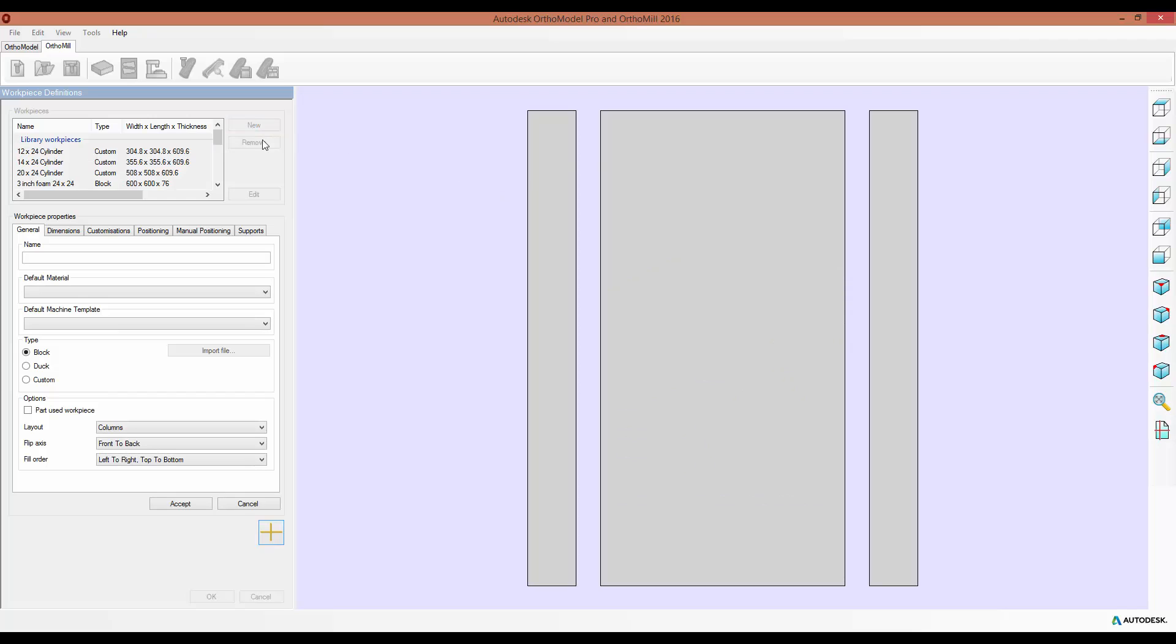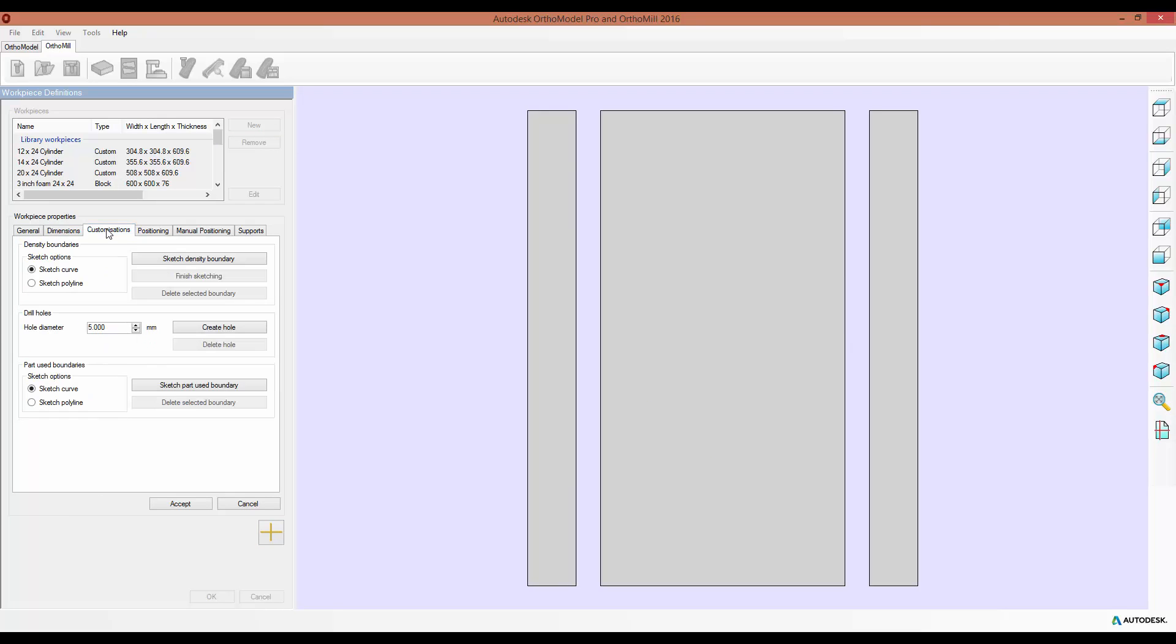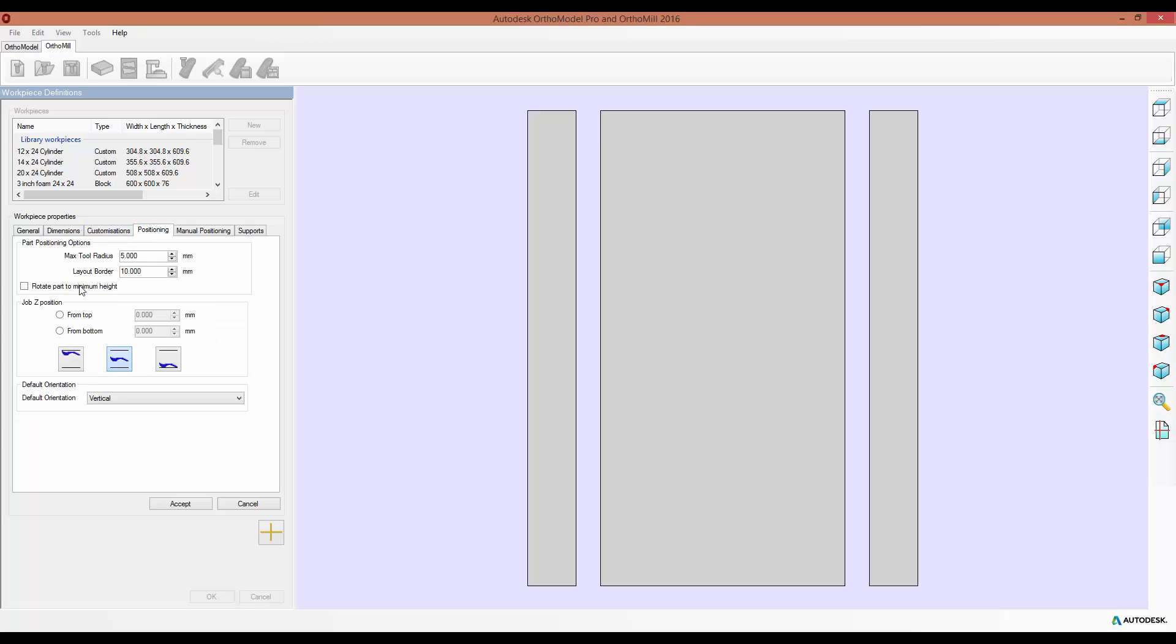So you can fill in all the information in the tabs which you already know. And then when you get to the Positioning, this allows you to set some of the default parameters for your job. So traditionally, the part was always positioned in the center of the workpiece by default.